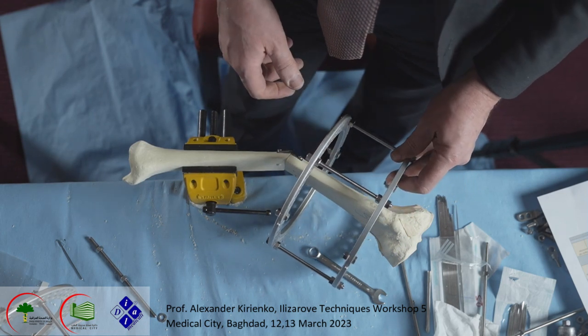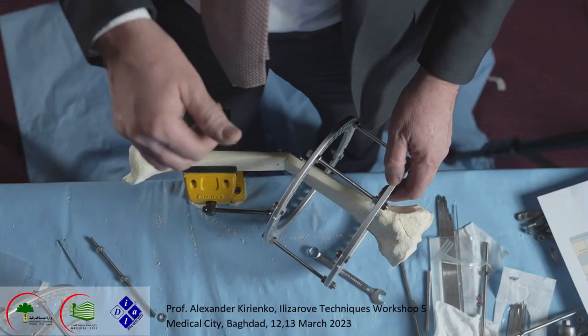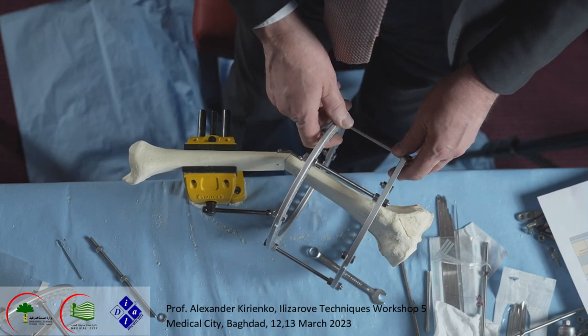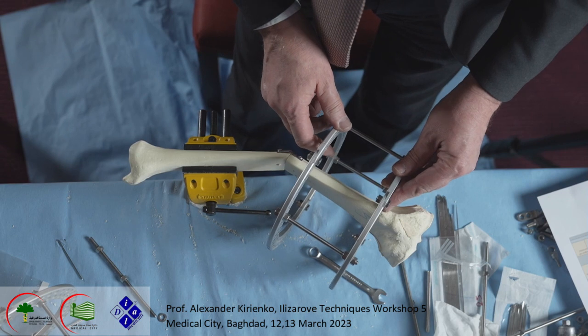I don't pre-build the frame because it's not so interesting. Pre-build is easy, and frequently we need to destroy it. But we build the frame slowly, step by step, attaching our hinges.